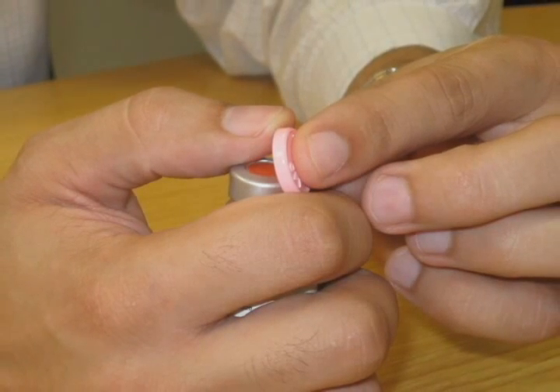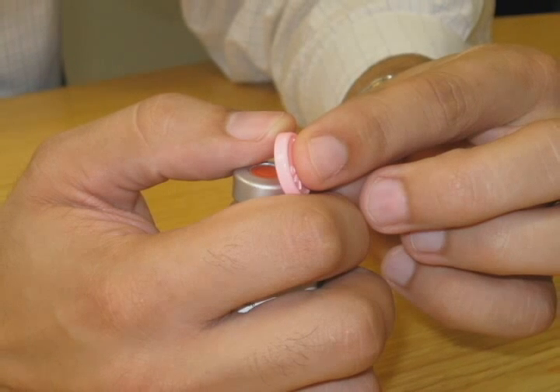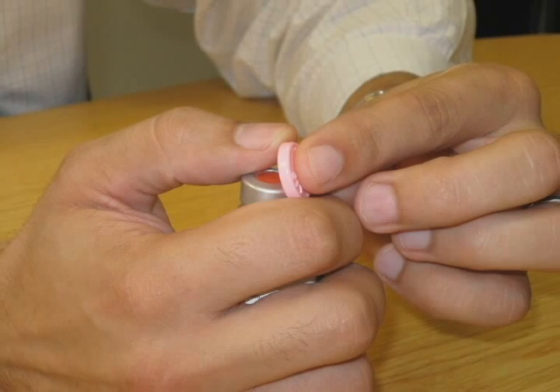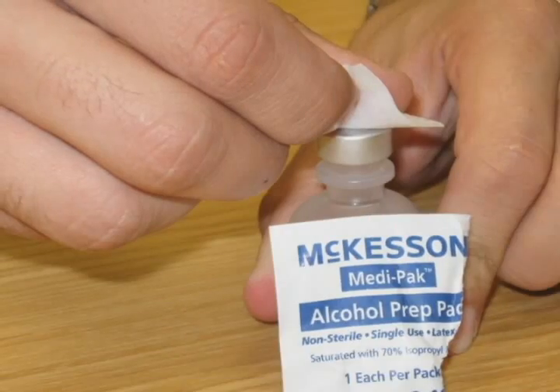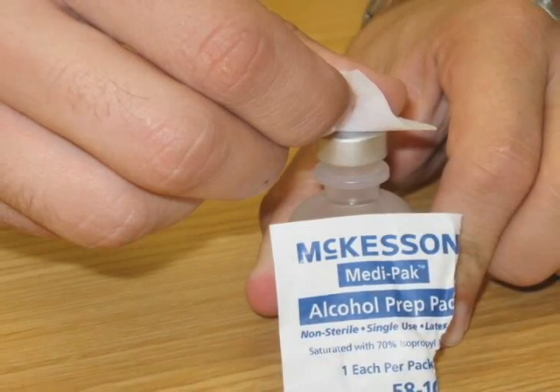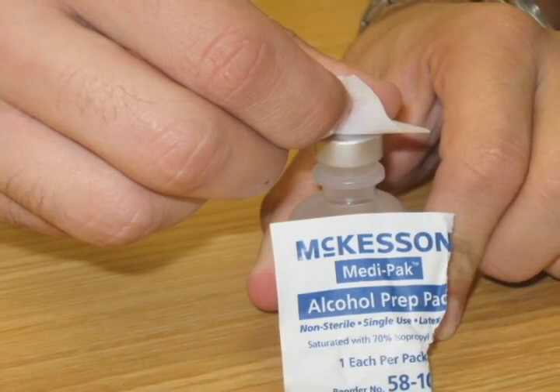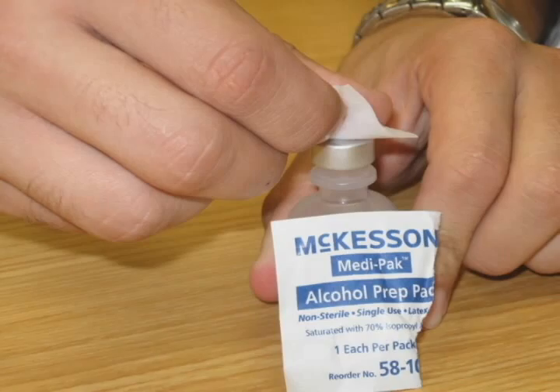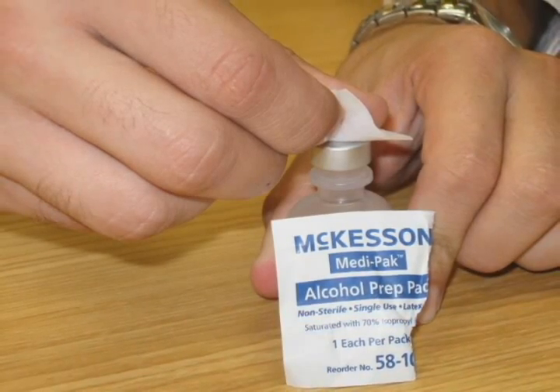If using a new bottle of insulin, remove the colored flat plastic cap that is on the top of the vial. The rubber stopper should now be visible on the top of the vial. Clean the rubber stopper on top of the insulin vial using an alcohol pad. You should do this each time you use the insulin. The insulin vial is now ready for use.